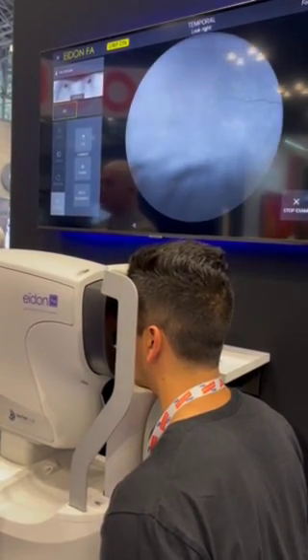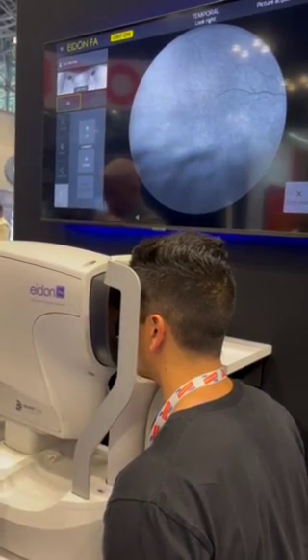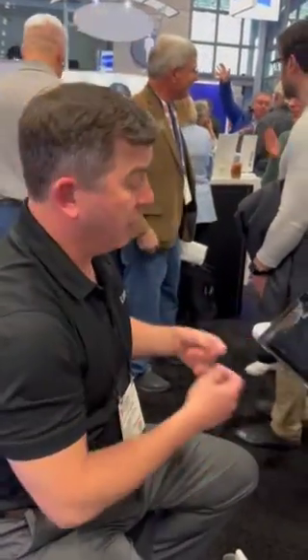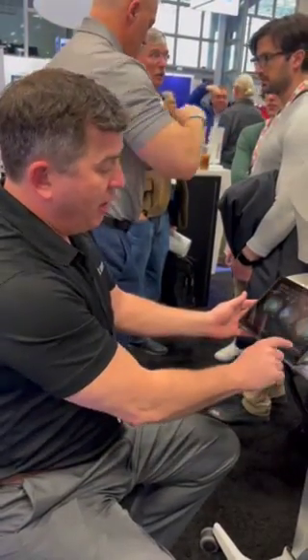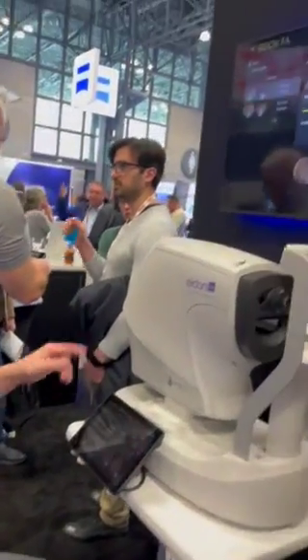We're down to three millimeter pupil size with a wide look. Now we're going to pull up those three images that we took. If those look good, we will create our mosaic, which is going to be 200 degrees. We have three really good images — we're going to create that mosaic.